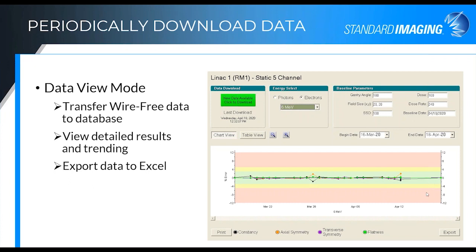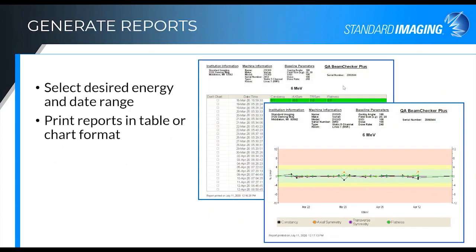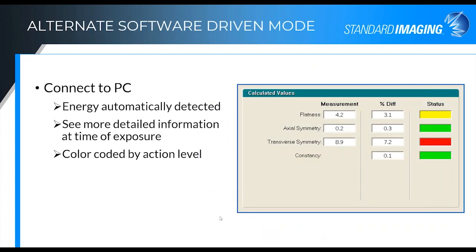So all of our values that we took from March through April were under that 3% error for all of our settings. If you'd like to export that data, you simply click on the button and it will give you a CSV file that you can download and review in Excel. And printouts, I can show you a mockup of what the printouts would look like, indicating all of the data that's available and the values that you had seen. And of course, there's a box on here for you to sign off on those reports to store and validate that you have done your diligence.